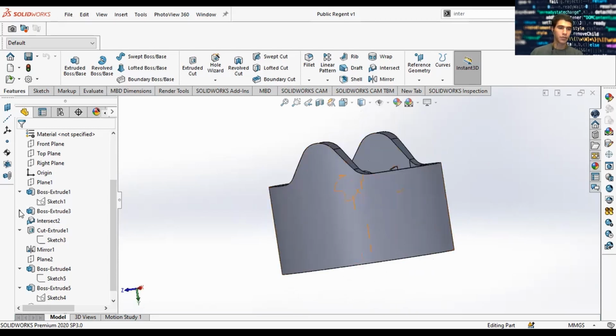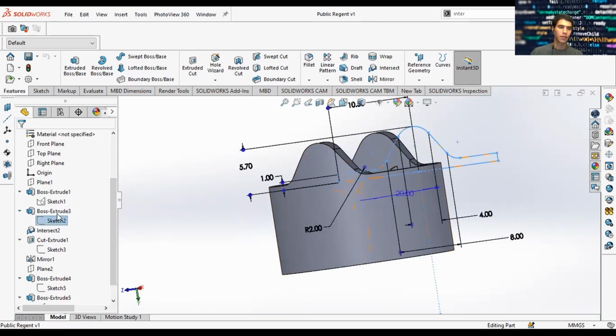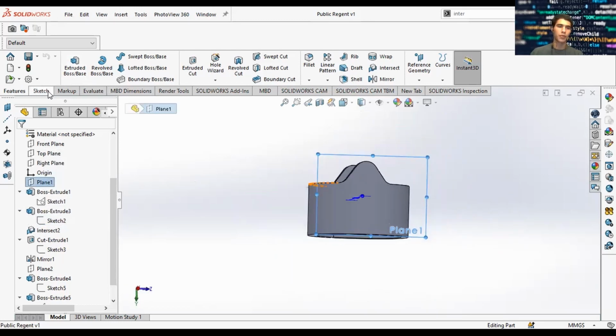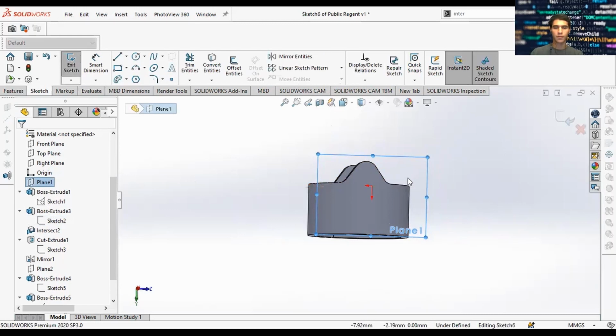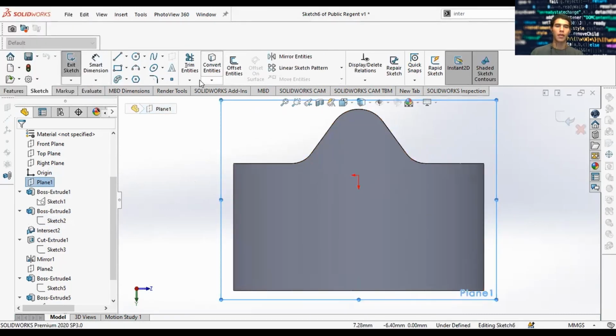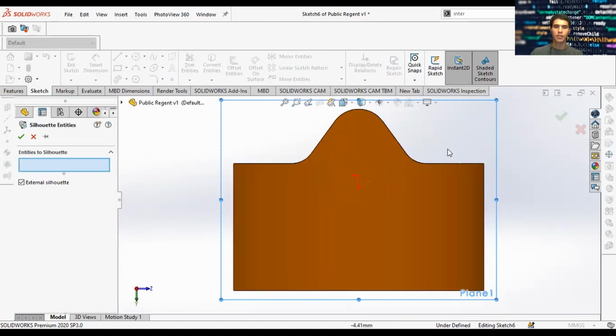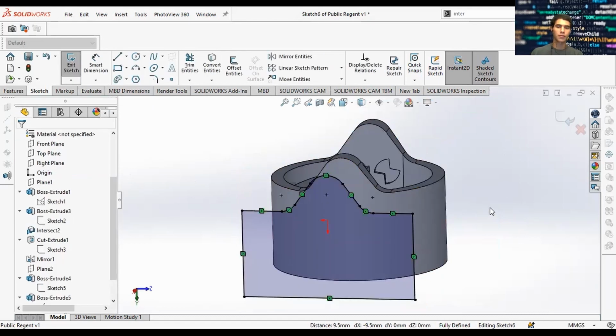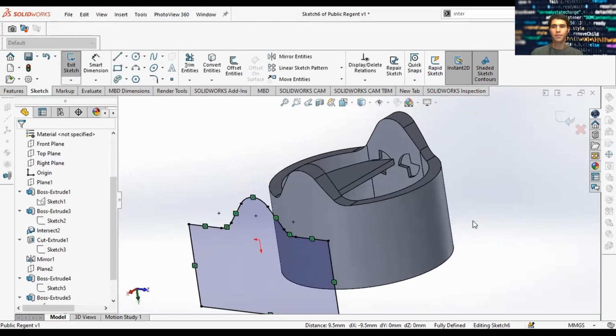Bring back our sketch 2. And which plane is that? Is plane number 1. So we're going to make a new sketch on plane number 1. And now let me introduce you to this feature called silhouette entities. Silhouette entities is going to take a body that you had and silhouette the entire body onto your plane. See what it just did there? It projected onto the outline of the silhouette.